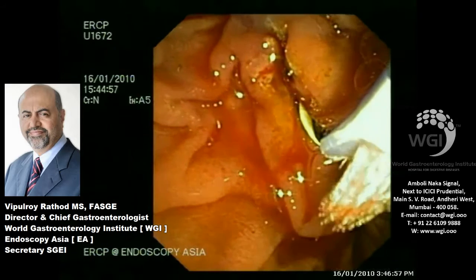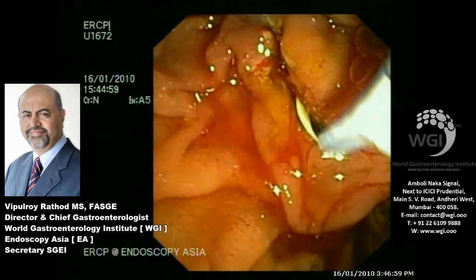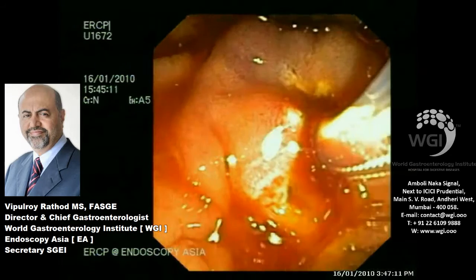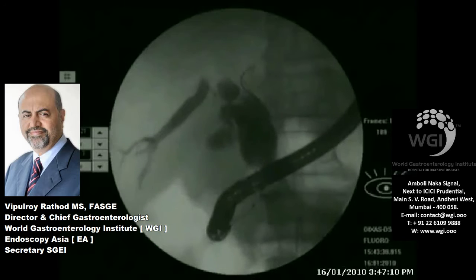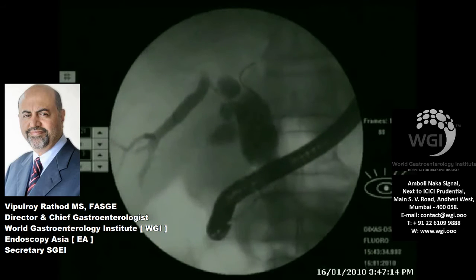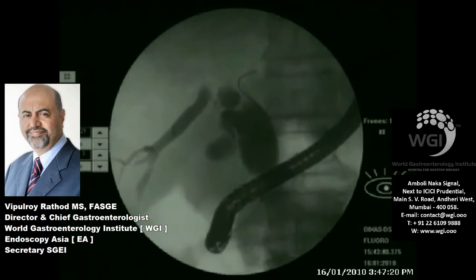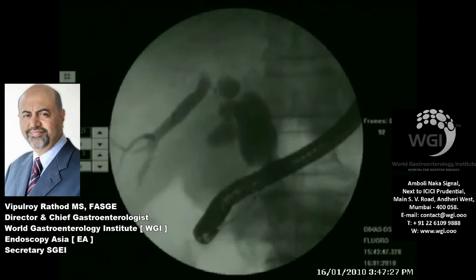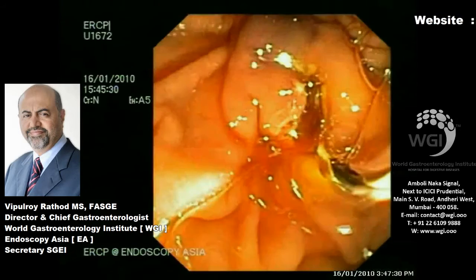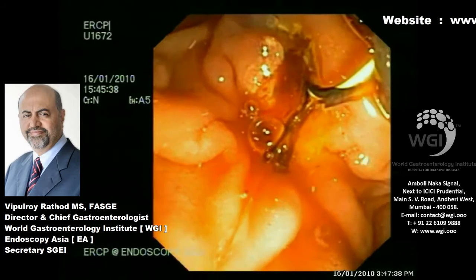It's standard practice because of our study protocol that for every patient with obstructive jaundice we do EUS-FNA as well as brushing. And we have compared our data, and I think there is no doubt that EUS-FNA is much superior and more accurate. And I think slowly and surely, as more centers start doing EUS-FNA routinely, the practice will change significantly.